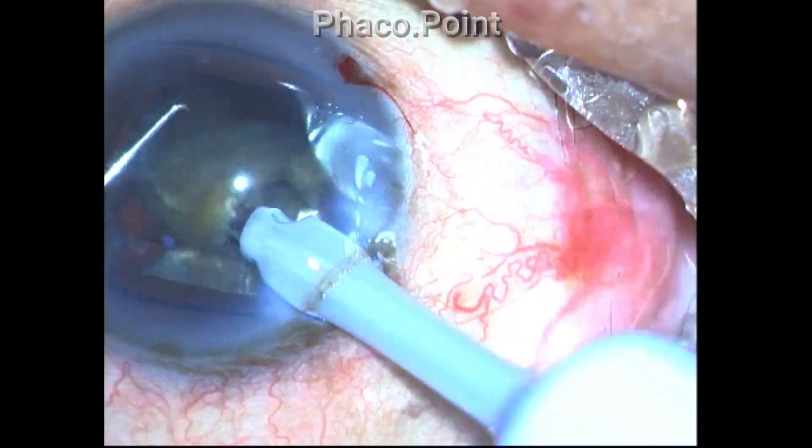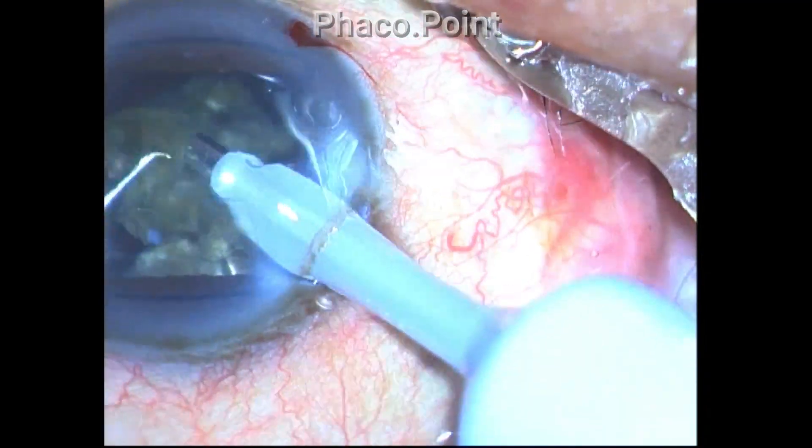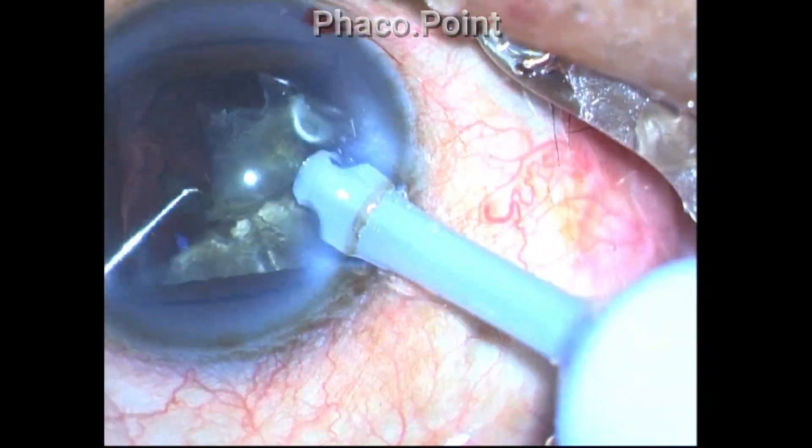You will notice that up till now the procedure was happening quite smoothly. In fact, there is no indication that something untoward is going to pop up quite soon.